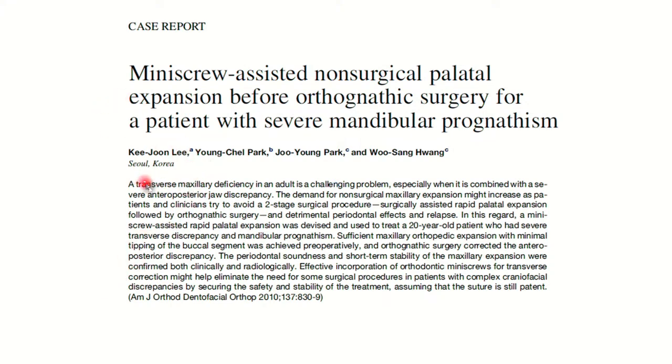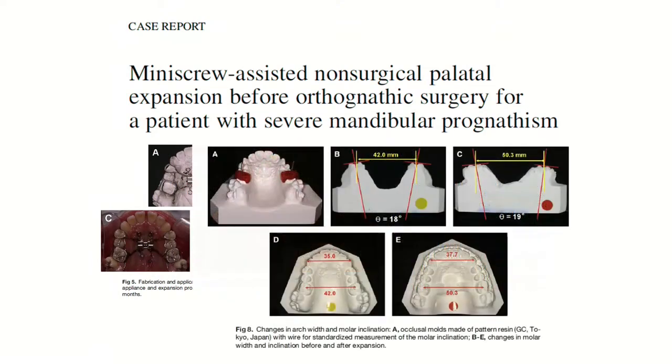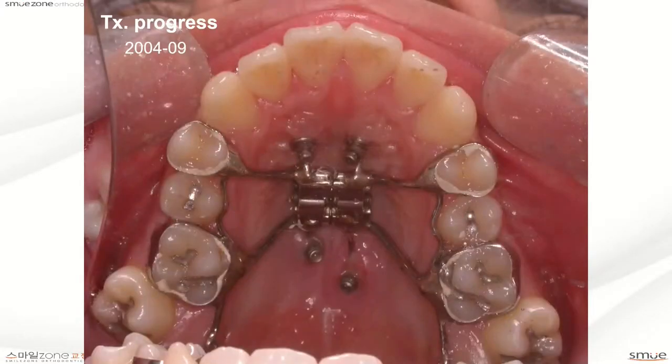Ki-jun Lee from Yonsei University in about 2010, about 14 years ago. Давайте поговорим с вами об аппаратах быстрого расширения с опорой на мини-винты. Впервые об этих аппаратах было упомянуто доктором Ki-jun Lee, который преподает в Yonsei университете еще в 2010 году.